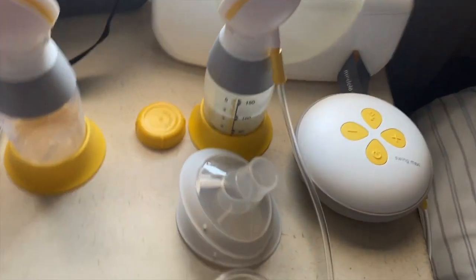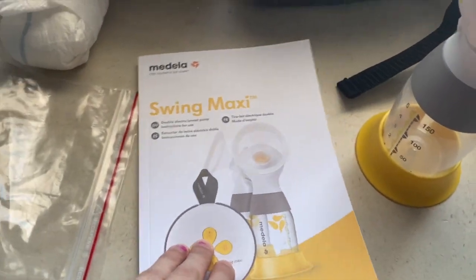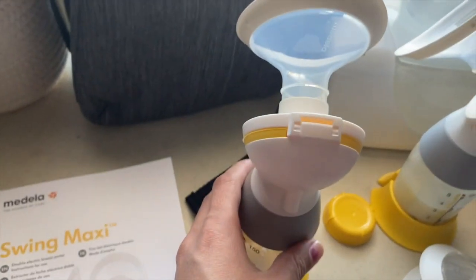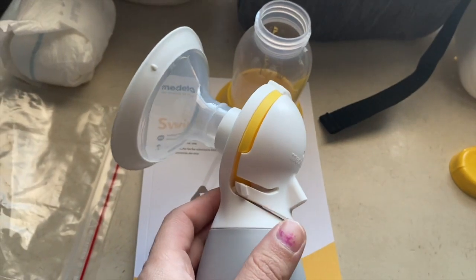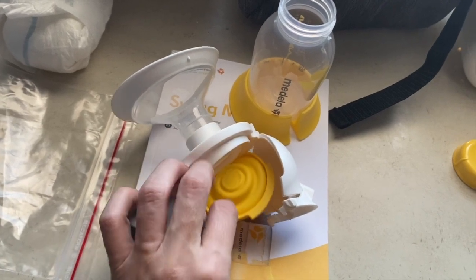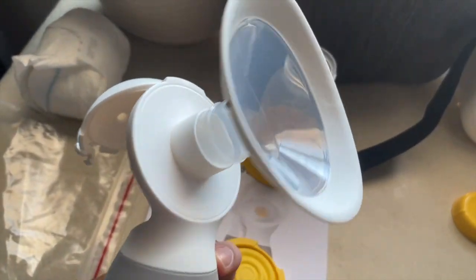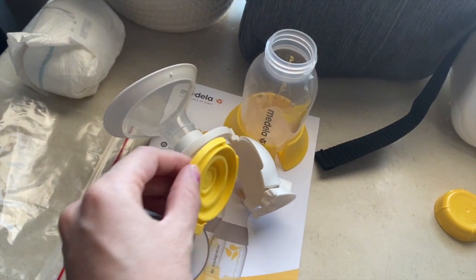What do you guys think? I love this pump way more than having to sit next to an outlet plugged into the wall. A cool thing is that to clean it, you just open this up and this little shield inside is all you need to clean. These are so easy to put together and use.